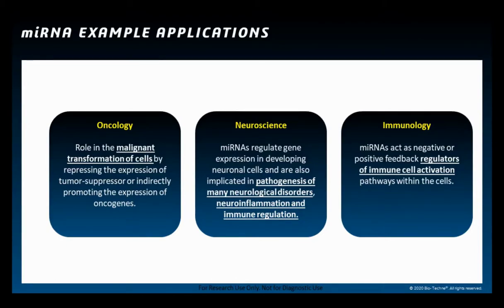So some of the research areas include oncology, neuroscience, and immunology. So how is microRNA detection relevant to oncology? MicroRNAs can actually alter the transcriptional landscape within single cells by targeting key players or even signaling pathways.